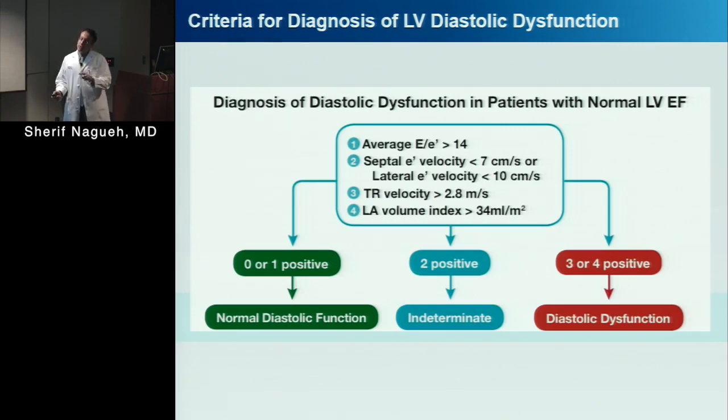So, two things. Sometimes physicians have acquired it and are using it to draw their conclusion without disclosing the value in the report. Sometimes it's in the report and they have used it, and sometimes they haven't even acquired it. But it is a standard of care. It is in the accreditation standards that labs should acquire it and use it.